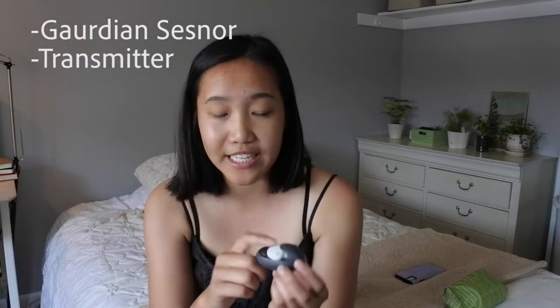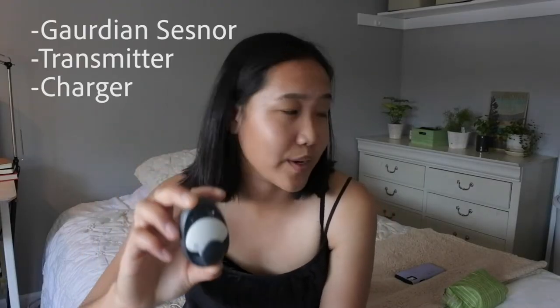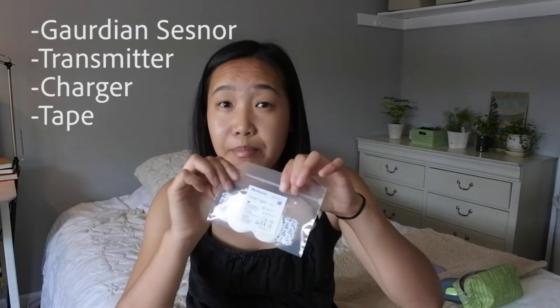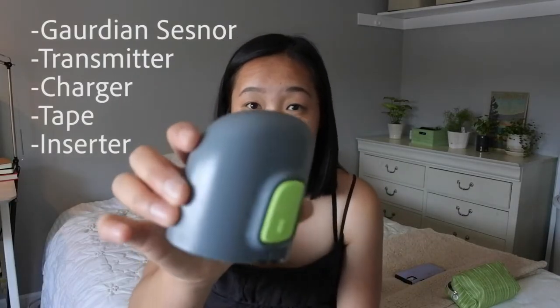What you're going to need for this is the Guardian sensor. You're also going to need your transmitter and have it hooked up to the charger before you do it. You'll also need some kind of tape — what I'm going to be using is a Guardian oval tape, which looks like this, and the inserter.